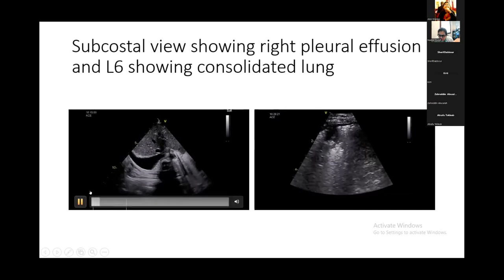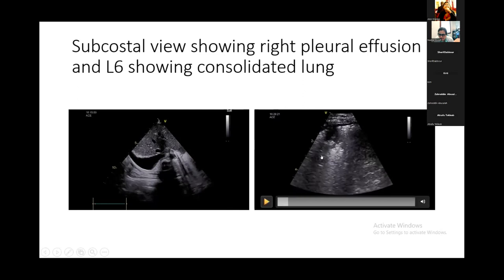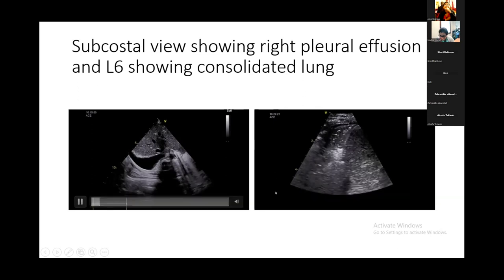Would you just describe, please, you've got a hepatization and then this rounded area on the other one, the one that's not moving. This one is pleural effusion, right side. This one? Yeah, this one. The round thing, is that a consolidation or is that effusion? There is effusion. The rounded thing in the middle, not in the middle, this one. This is hepatized lung, actually. Hepatized, okay. I don't know why it is not moving, but yeah, you can see hepatized lung. Yeah, you can see this.